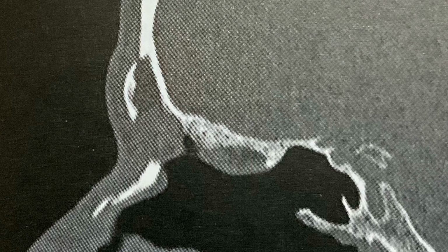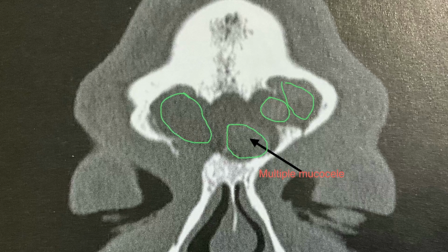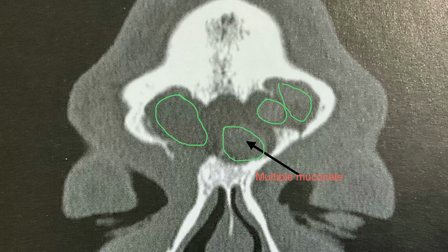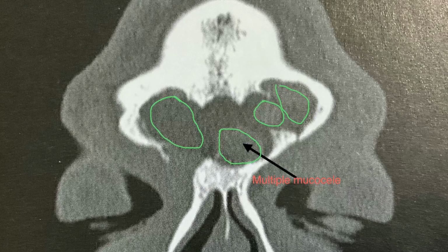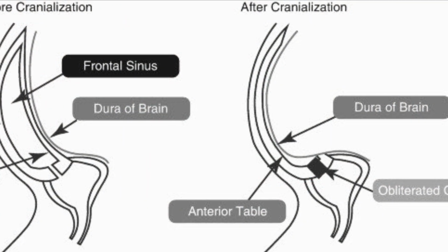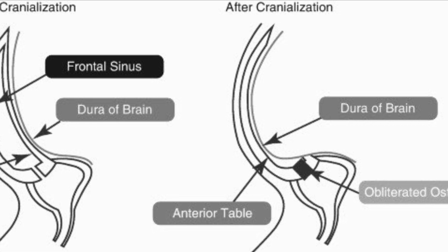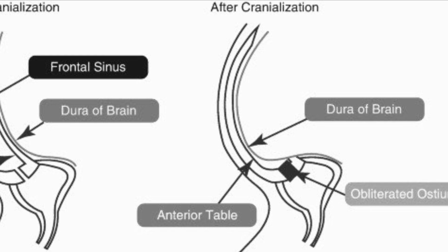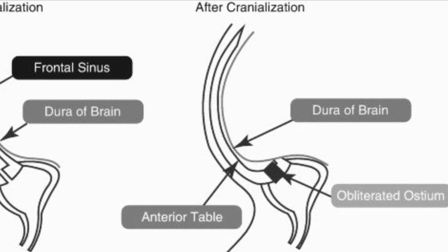The osteoplastic flap remains an invaluable technique for certain complex cases. It is particularly beneficial when endoscopic approaches fail or are deemed insufficient, such as in high or lateral mucocele formations. The combination of traditional surgical skill and modern technology underscores the importance of preserving these methods in an era of rapid surgical advancements. This technique serves as a testament to the balance between innovation and established surgical practices, continuing to provide solutions for patients with challenging frontal sinus disease.